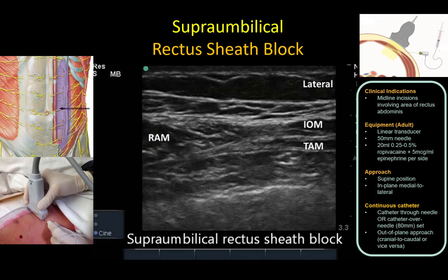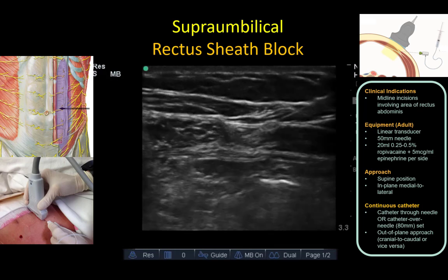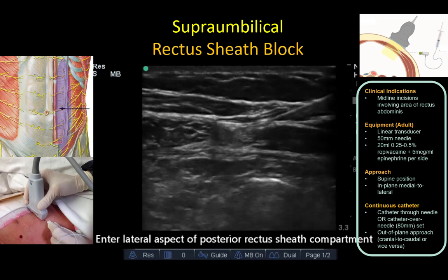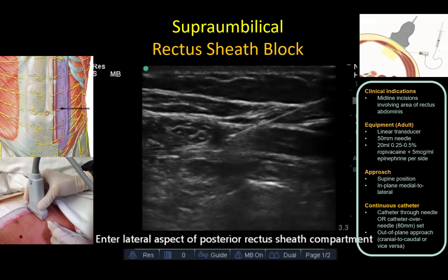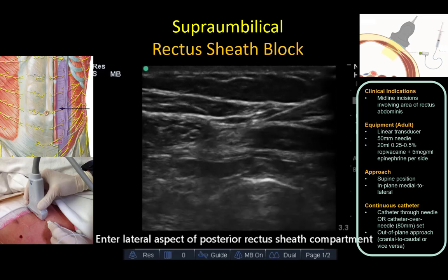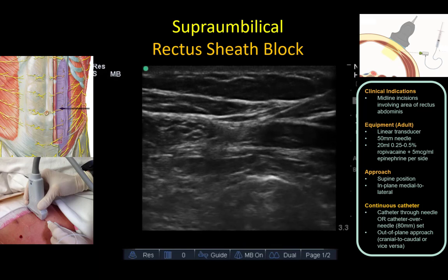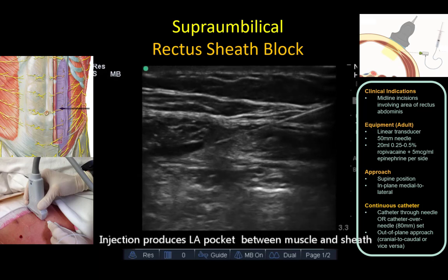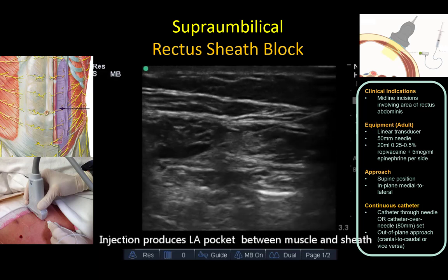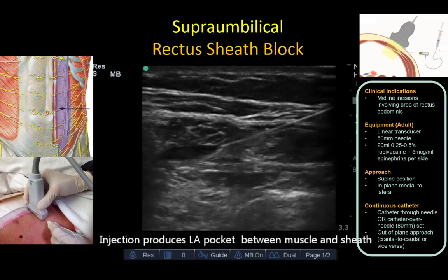This video illustrates a supraumbilical rectus sheath block. The block needle is inserted into the lateral aspect of the sheath deep to the muscle, ensuring that the tip stays above the posterior layer and within the sheath. Local anesthetic separates the muscle off the sheath, producing the classic lenticular spread pattern of fascial plane injection.